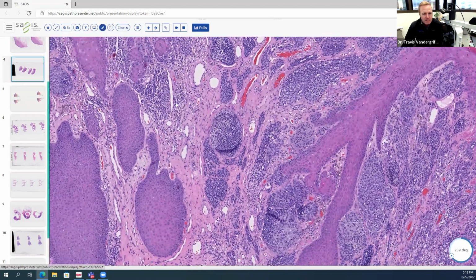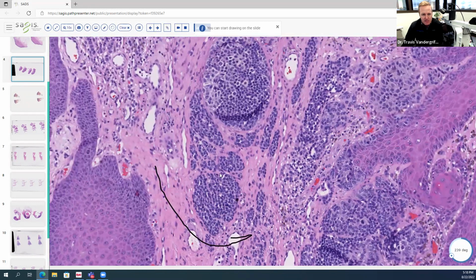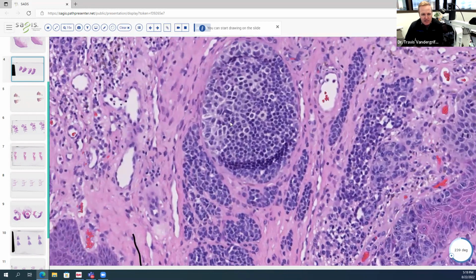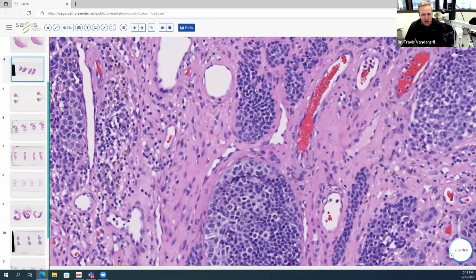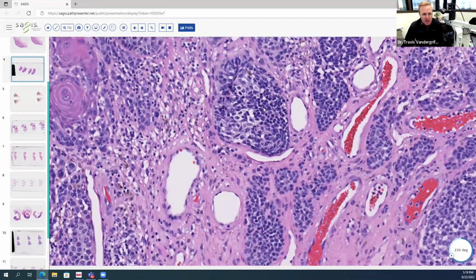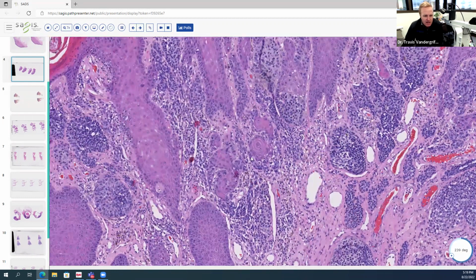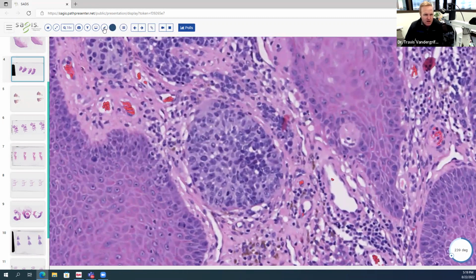The melanocytes in the deep part of the dermis are remaining nested, they're crowded, they have abundant cytoplasm, and, though the view there is a little bit blurry, there's nuclear atypia. So these cells look pleomorphic. And if I scan here, I think we'll find some areas where you've got mitotic figures.